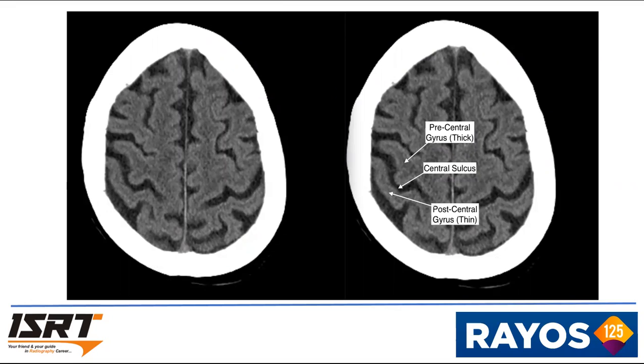There may be occasions where a technologist may drop this image while filming. Never ever make that mistake. So in this slice, you can see the central sulcus. The central sulcus is a very important structure. It differentiates the frontal lobe from the parietal lobe. In front of the central sulcus is the precentral gyrus, and behind the central sulcus is the postcentral gyrus.